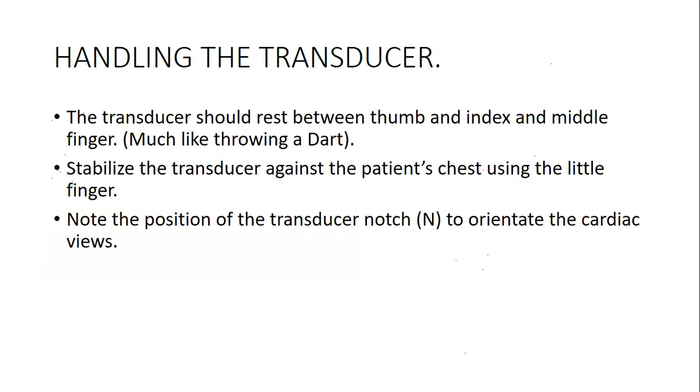How do you handle the transducer? It's the same probe that we normally have, but make sure you hold it like you are throwing a dart. It's the same probe, except that the images in echo are inverted, which I will explain.